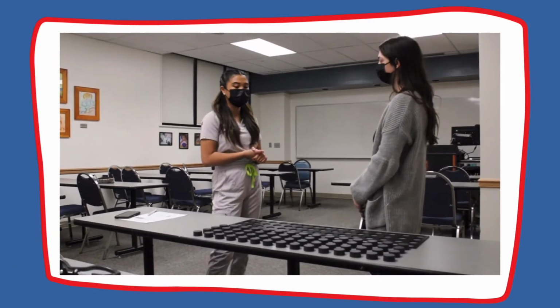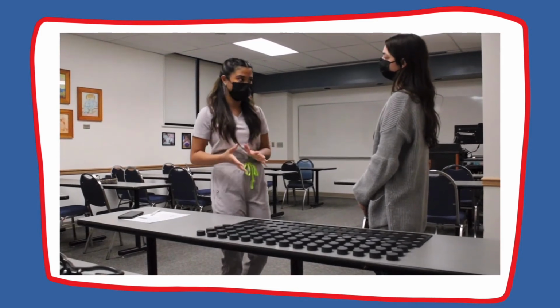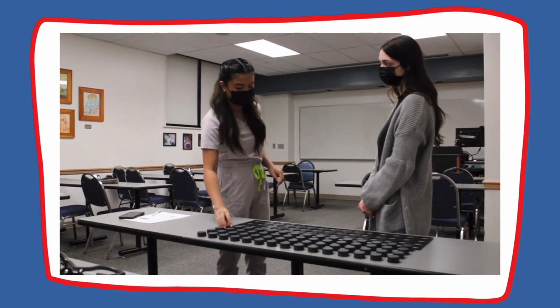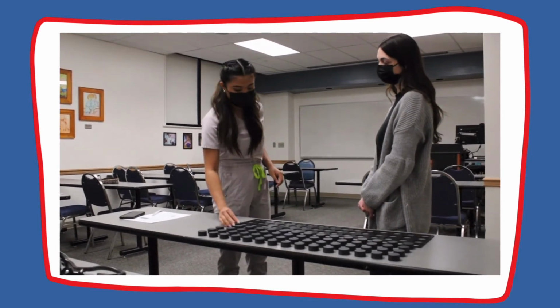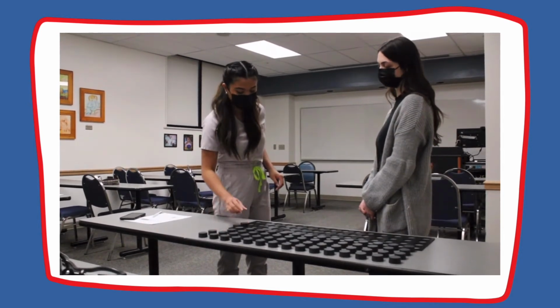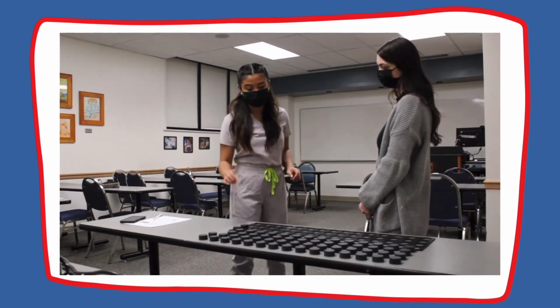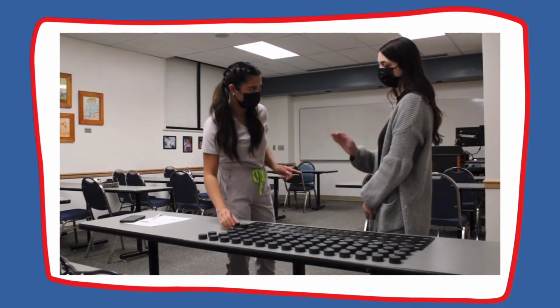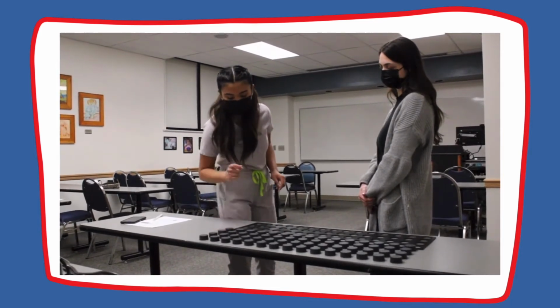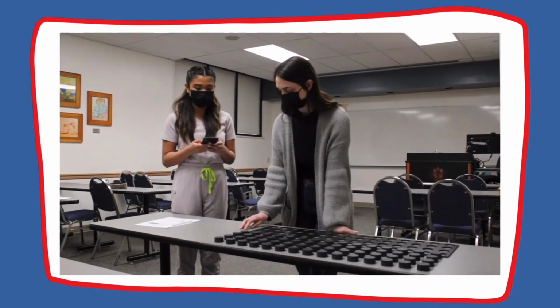Okay, so we're going to be testing your eye-hand coordination. We're going to be using this test right here. So what I'm going to have you do is just pick up these discs and put them into the holes. And then you'll just pick up the next disc and do it and so on. We're going to start by using your dominant hand. Which one is your dominant hand? Right. Your right hand? Okay, perfect. And while you're doing that, I'm going to time you, so do it as fast as you can, okay? Ready, and go.